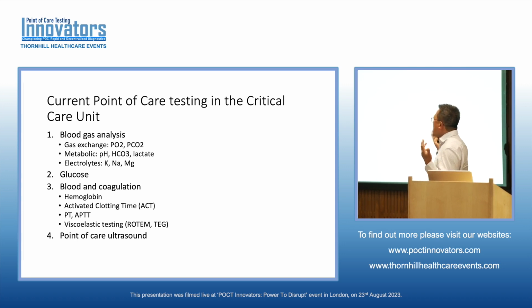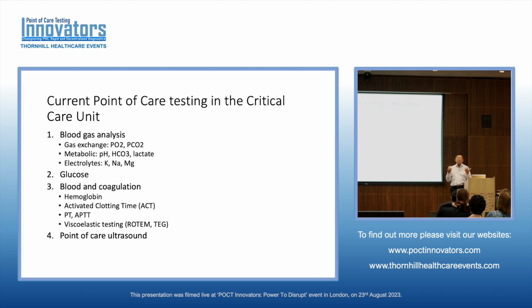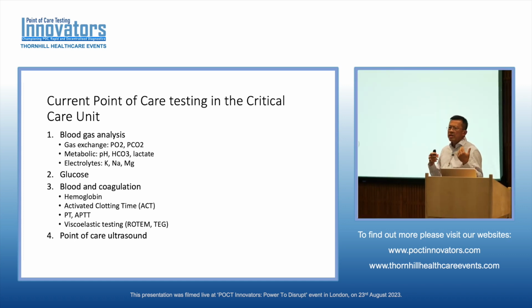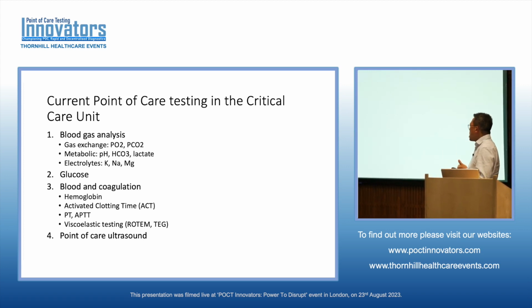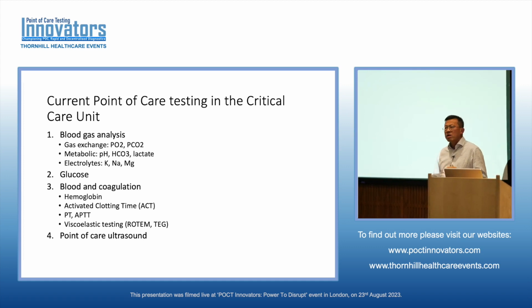And then glucose and blood coagulation, which has become much more of an area of interest because I am principally a cardiac surgery, cardiac anesthetist and cardiac intensive care sort of clinician. And over the last nearly 20 years or so, I've been taking a special interest in coagulation. And really, the laboratory doesn't provide me with much in the way of useful information about blood coagulation in a timely manner, at least. So I have been using, if you like, point-of-care coagulation testing, which I'll cover a little bit in a moment.